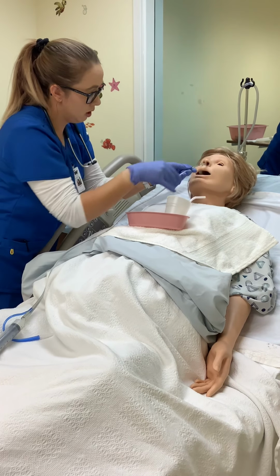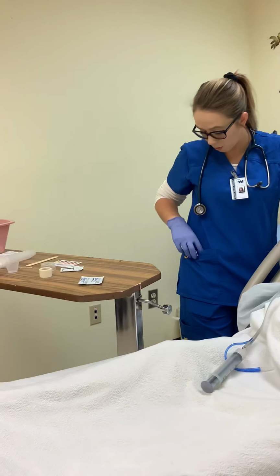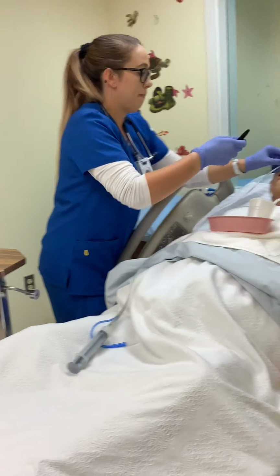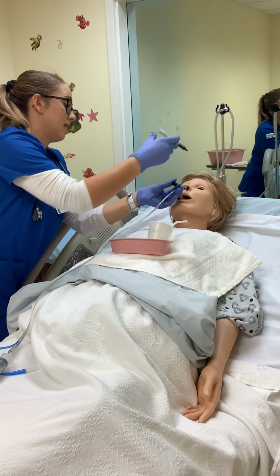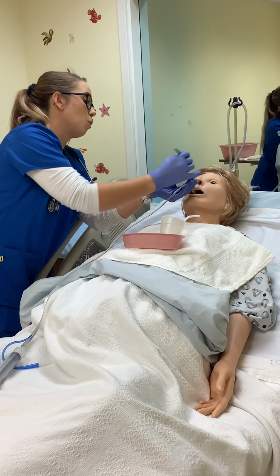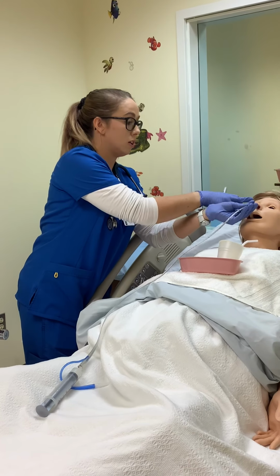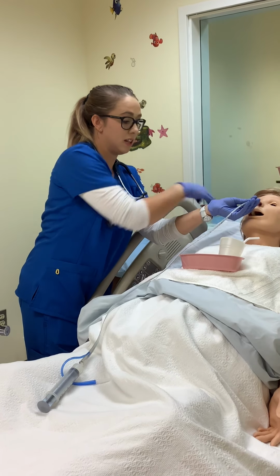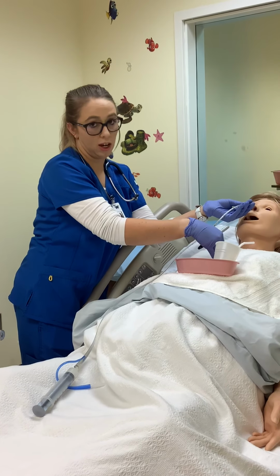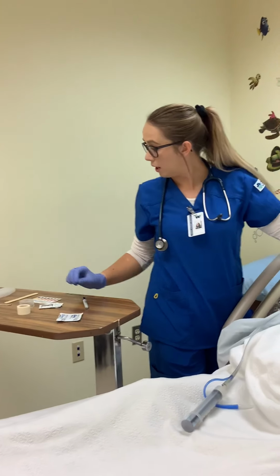There we go. So now that it's far down in there, what I want to do here is mark it. As well, I did forget, but you would mark it in the beginning when you measured your NG tube from the tip of the nose to the ear and to the ear down to about the mid-chest. So I would do that right there.